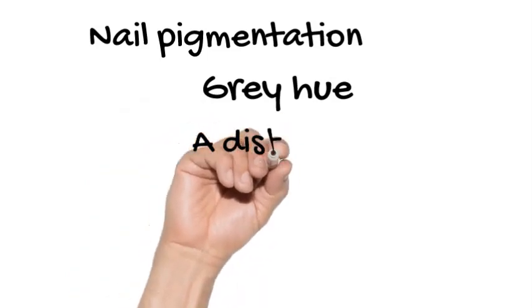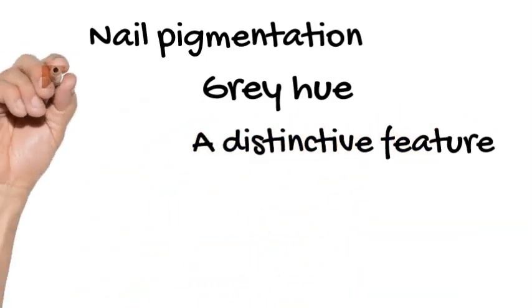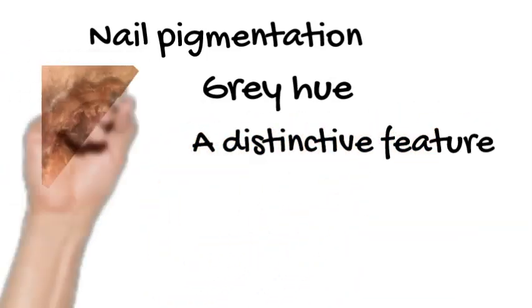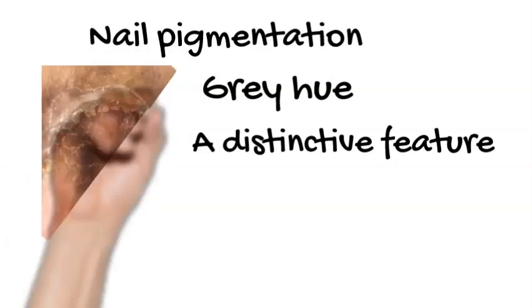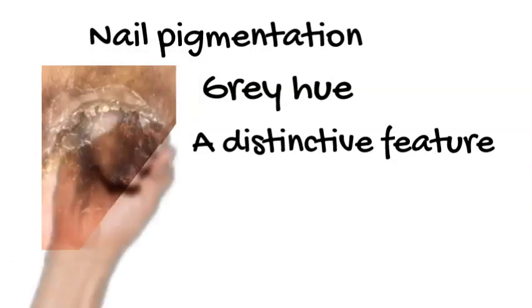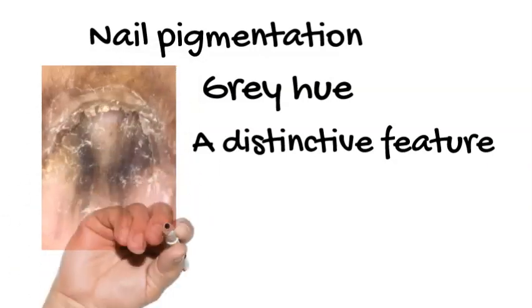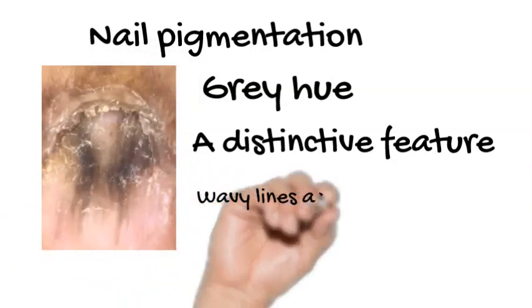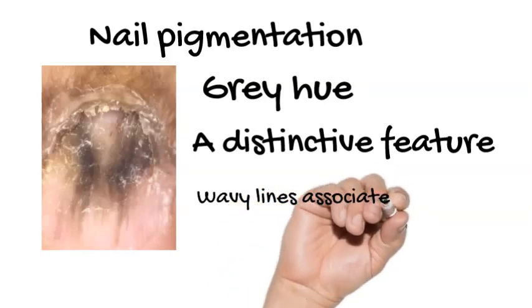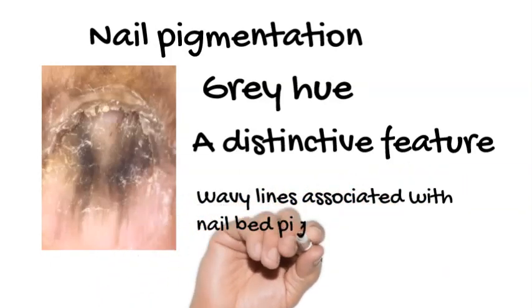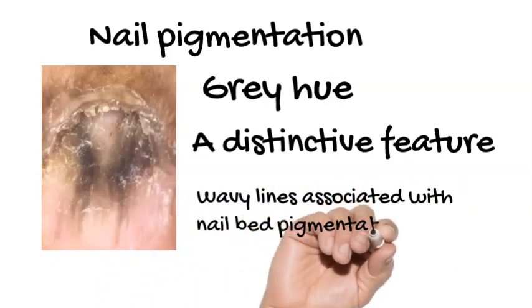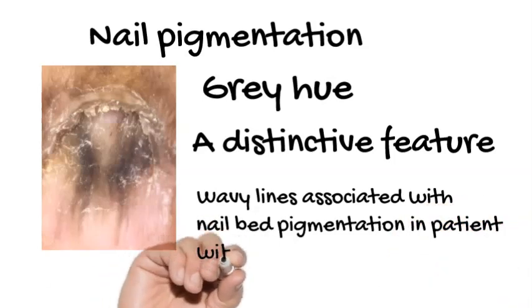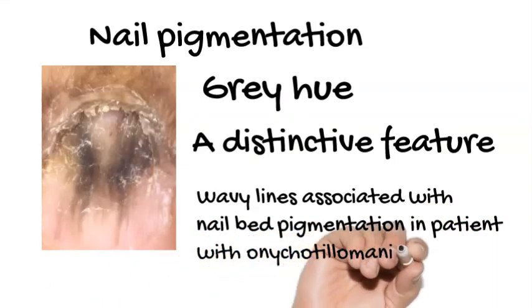Regarding nail bed pigmentation: it appears as a gray hue, and this is a distinctive feature of onychotillomania. In this photo, there are wavy lines associated with nail bed pigmentation in a patient with onychotillomania.